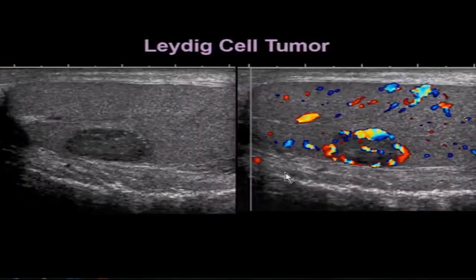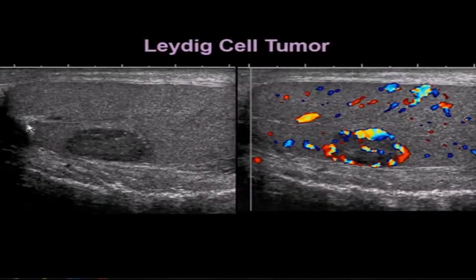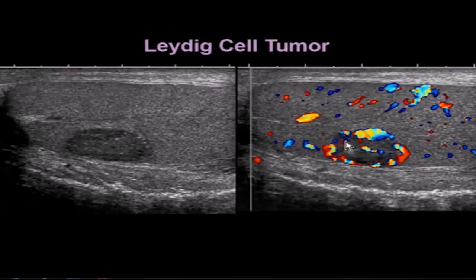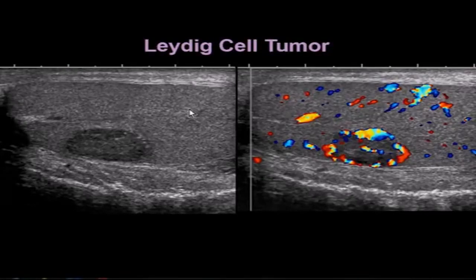Here's a Leydig cell tumor. We see a well-defined hypoechoic mass in the testicle with surrounding parenchyma. Note how hypervascular this lesion is as well. So while this one was benign and the prior was malignant, both tumors had increased vascularity.